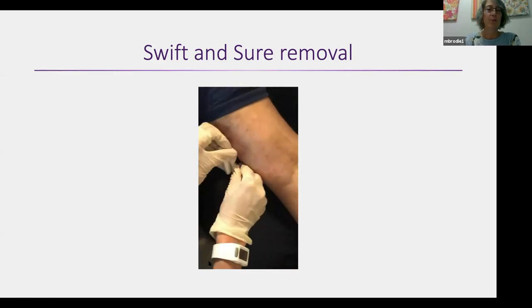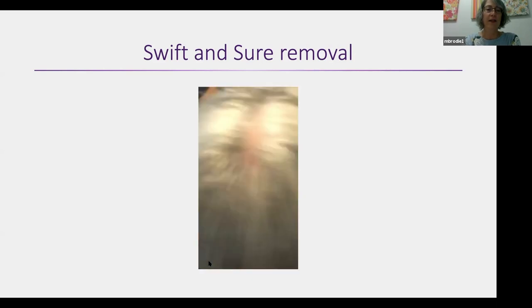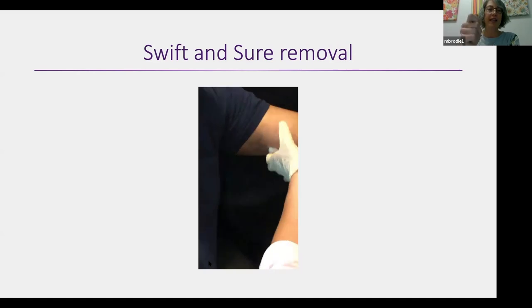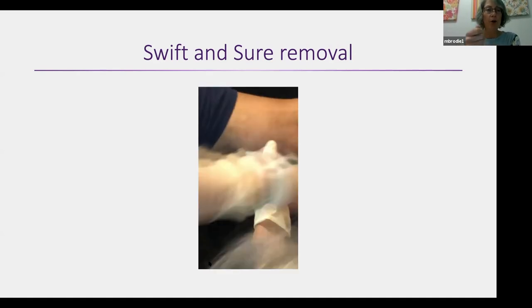So I'm just putting some traction on the skin so that I'm not working against too much. And there, it's very much a flick of the wrist, where you've really got to be swift and sure, because if you're too gentle, you are going to be pulling on it far longer than you need to. And that is actually what's going to make it uncomfortable for the client. If you're doing it nice and quickly, you're going to be able to get it out faster.